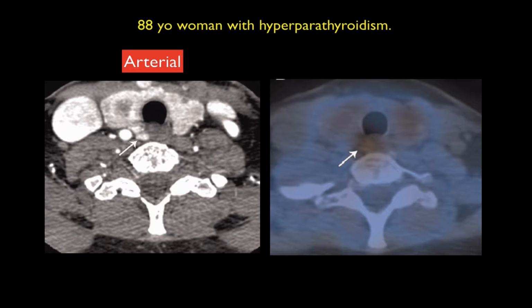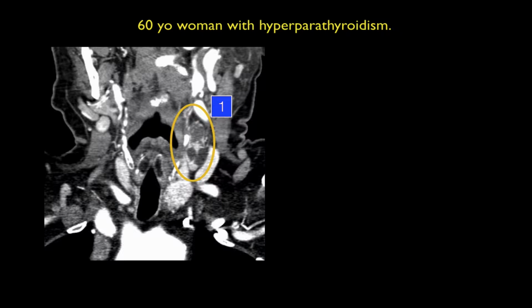This next case is a parathyroid adenoma in the right paraesophageal location, which is now seen in retrospect on the scintigraphy study, although it was called negative initially and possibly confused with uptake in the esophagus. And this final case is a tricky one.